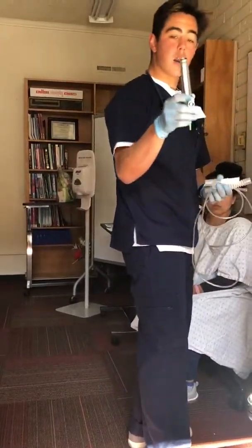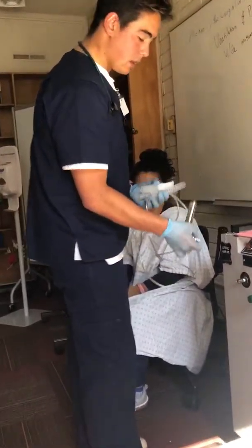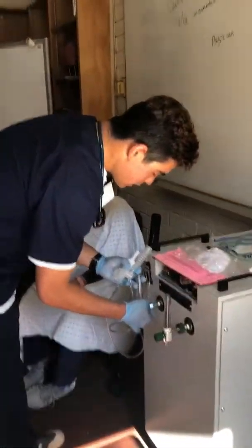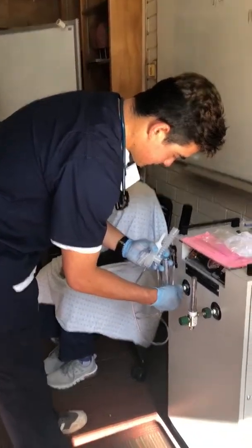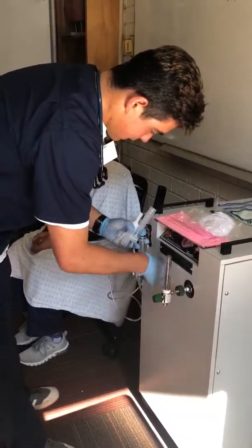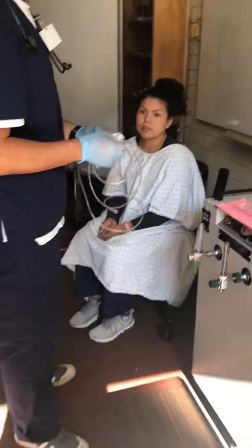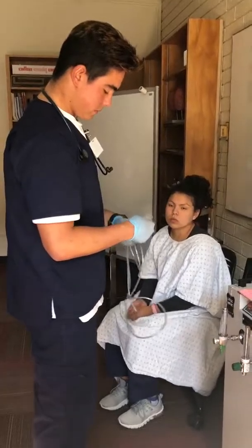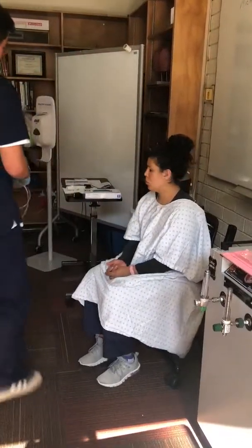So we're going to plug our 50 psi in. We're going to plug into the 50 psi wall outlet. Make sure that's nice and flush. We are going to plug in one end of our tubing to the wall. It's down here right now.